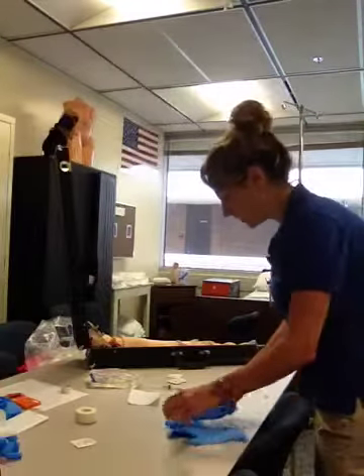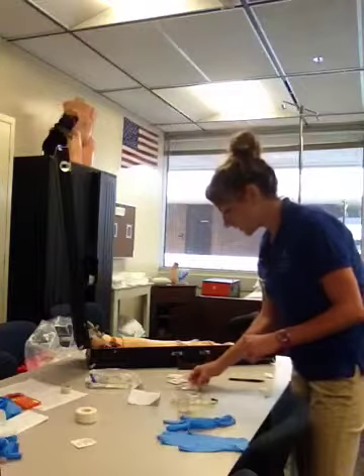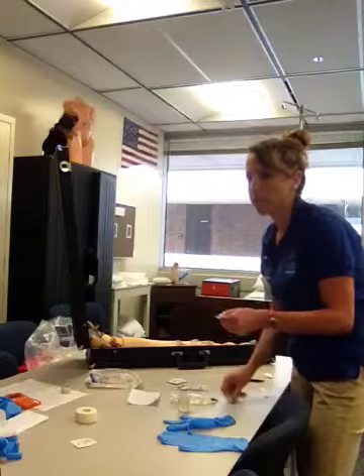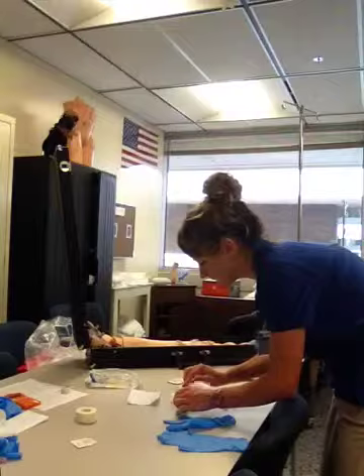Okay, so I'm going to have clean hands here, and I am going to pull up 4.8 milliliters of Herceptin, our drug.